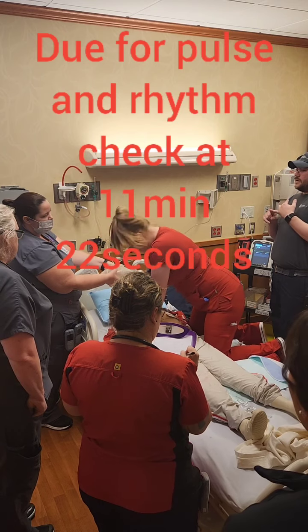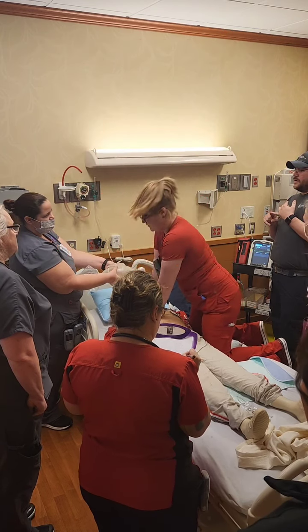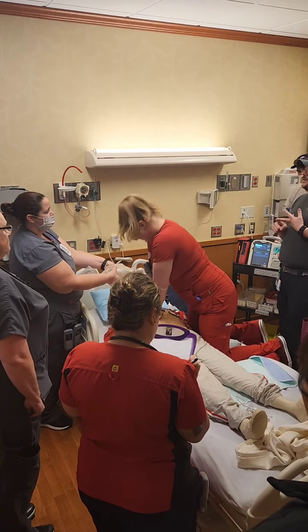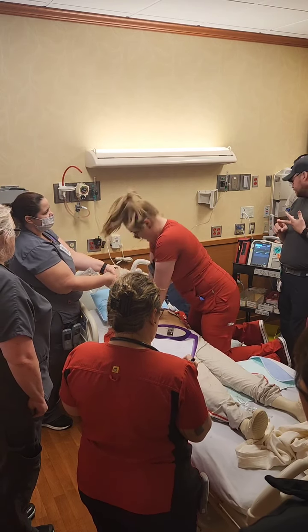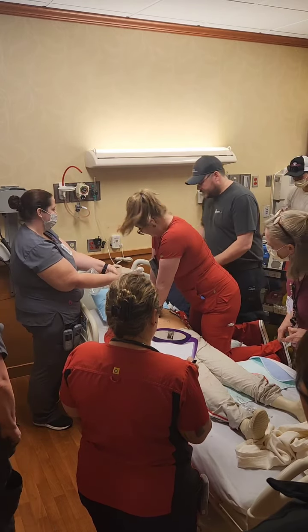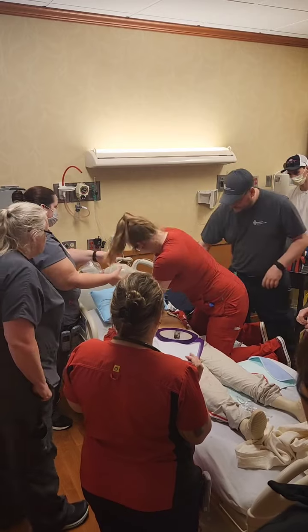You do actually cycle an okay blood pressure for CPR, 86 over 53 with the chest compressions there. Okay, what about our end tidal? Oh, yeah, I got to hook it up.